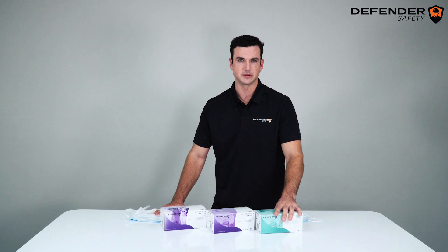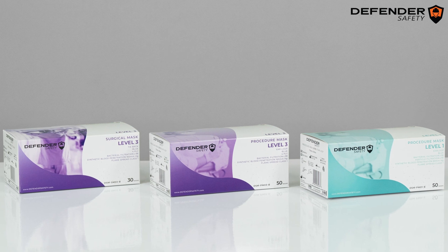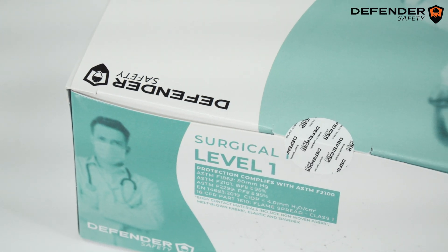Now let's take a look at our packaging. We have a clear color-coded system and easy-to-read labeling so you know exactly what performance level your mask has. Additionally, all our packages have a quality control seal to ensure that the product has not been tampered with.